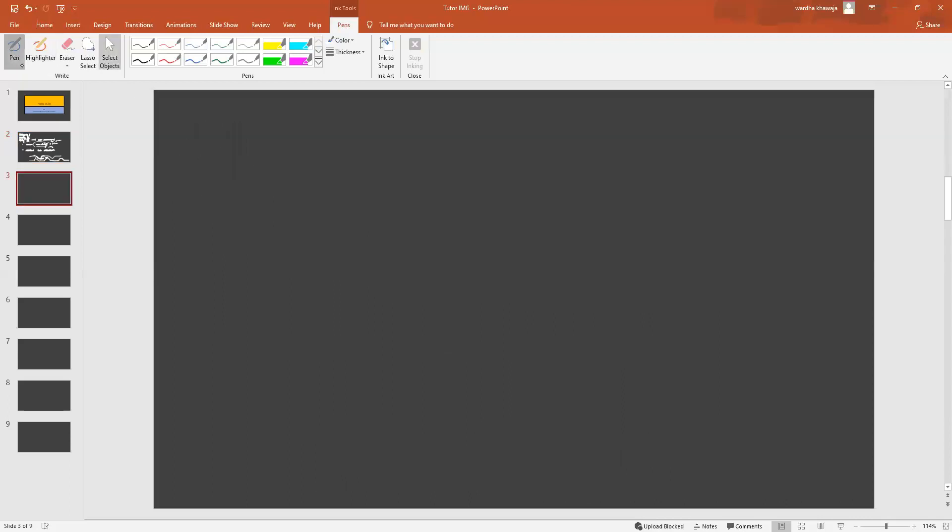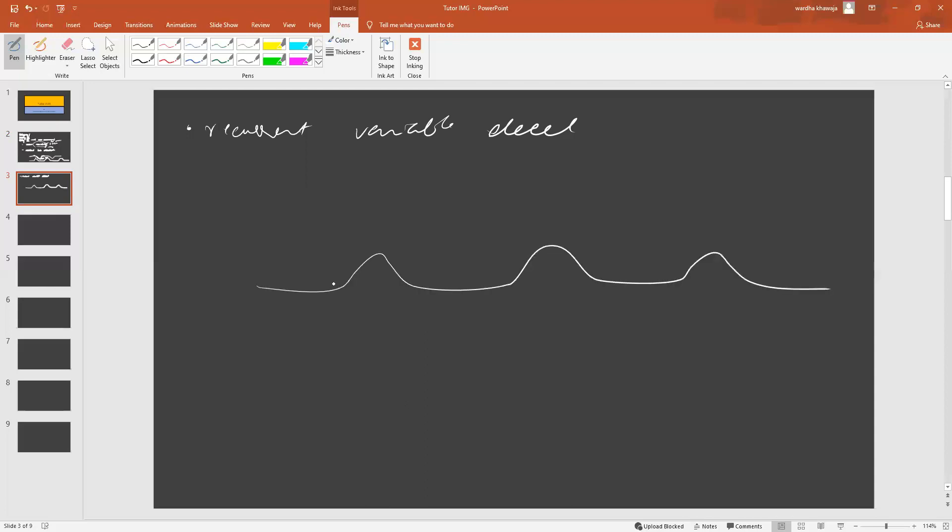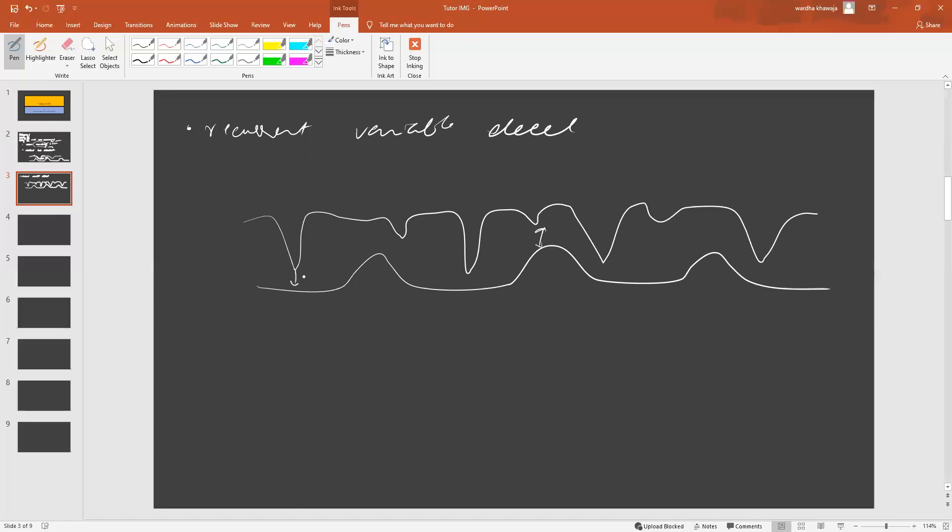Third thing that we have to consider is what we call recurrent variable deceleration. What does this mean? Again, the mom's contraction peaks this way, whilst the baby's heart rate will fall like this. Some peaks might line up, but most of them are dipping without any relationship to the maternal contraction.